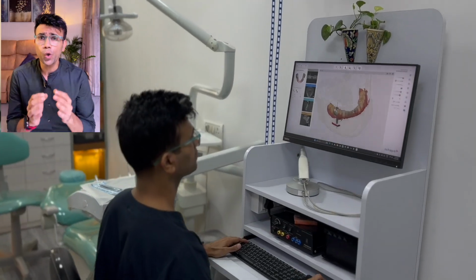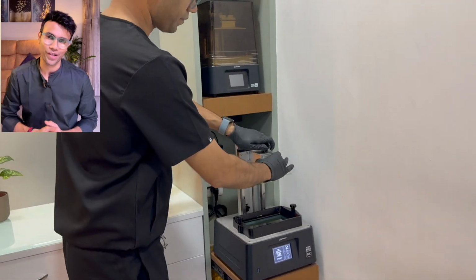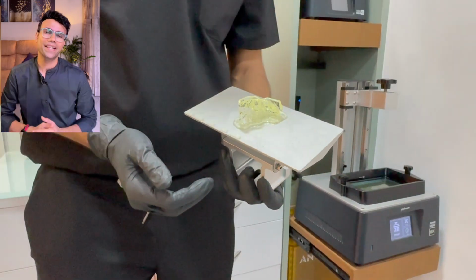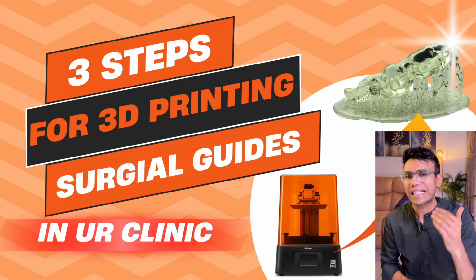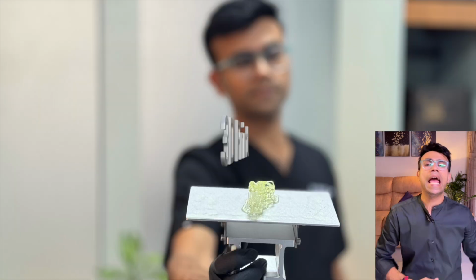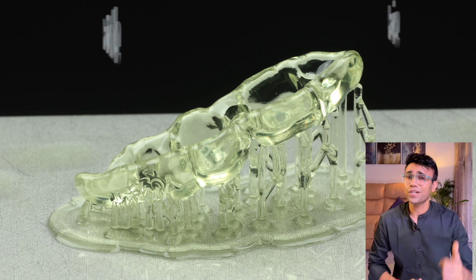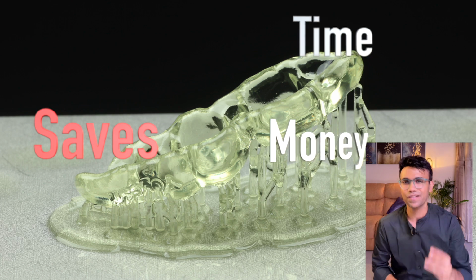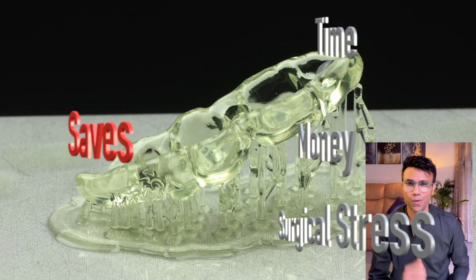What if you could plan your implant cases today and 3D print your surgical guides in your own clinic by tomorrow morning? No outsourcing, no waiting, no complicated tech. In this video, I will walk you through exactly how dentists can design and print precise, predictable implant surgical guides right from their clinic, saving time, money, and surgical stress. Let's make digital dentistry truly in-house.